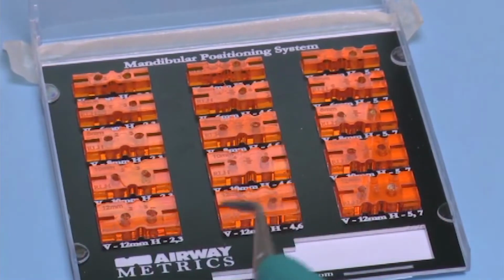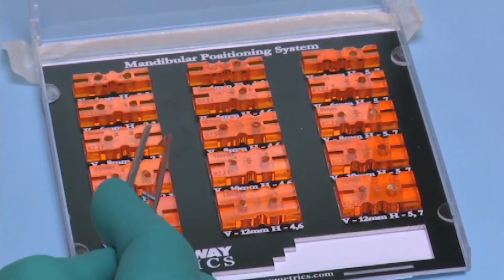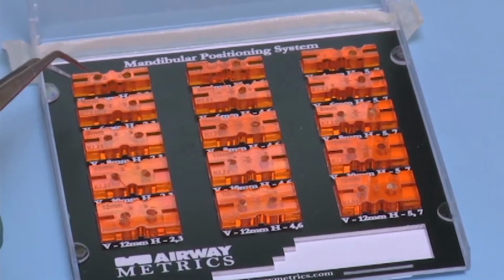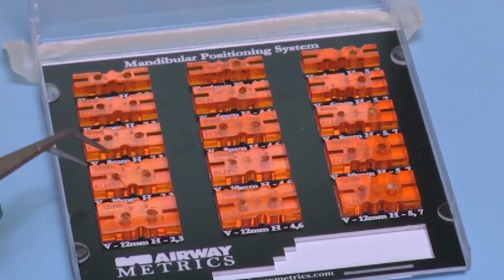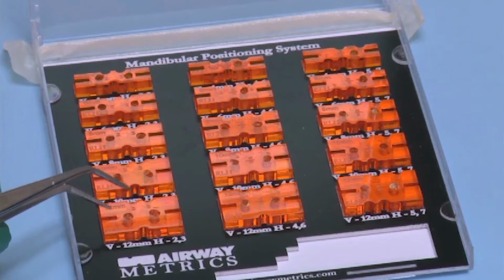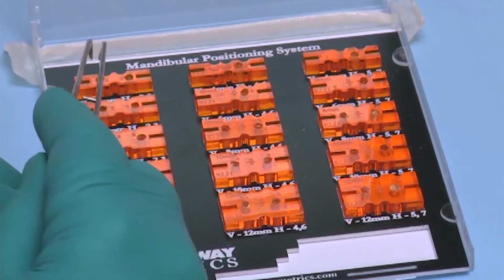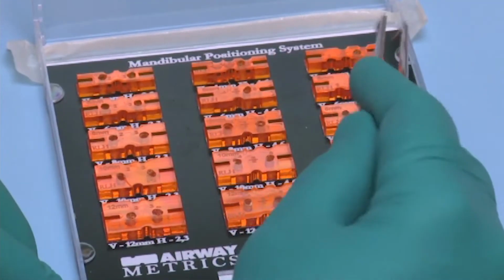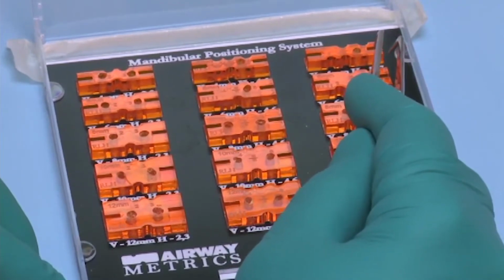Let's go back to the Airway Metric system. Each one of the keys is set up appropriately at either 4 millimeters of vertical, 6 millimeters of vertical, 8 millimeters of vertical, 10 millimeters of vertical, or 12 millimeters of vertical. Then if you go horizontally, it goes from 2 millimeters of horizontal movement or protrusive all the way up to 7 millimeters of horizontal movement or protrusive.